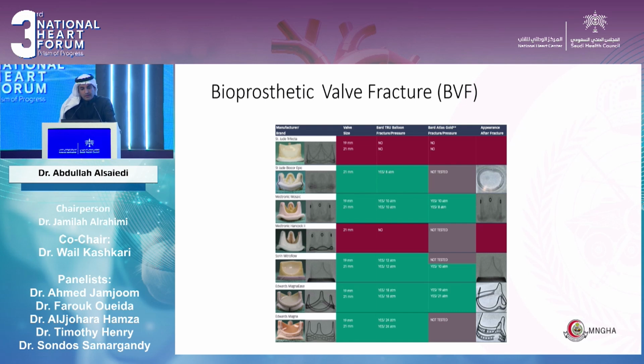So when you talk about bioprosthetic valve fracture in general, it depends on the response. Not every surgical valve responds similarly. Some surgical valves are not fracturable by balloon. Talking in general, some valves will truly fracture, but it depends on the site of fracture. Some of them have a swing, some are total separations. So depending on the type of the surgical valve, the fracture might be visible or not, and the fracture itself might be different from valve to valve.